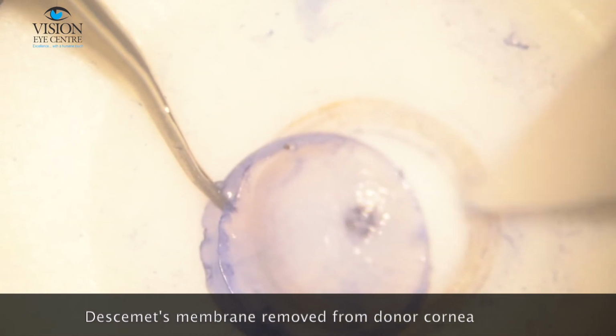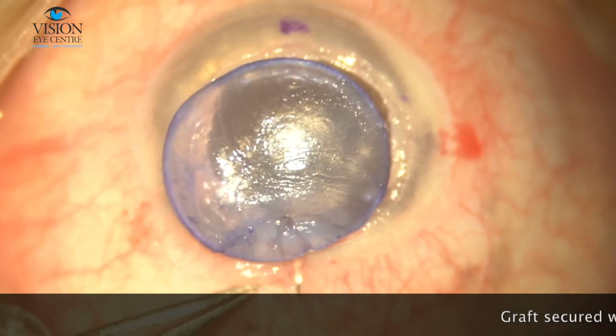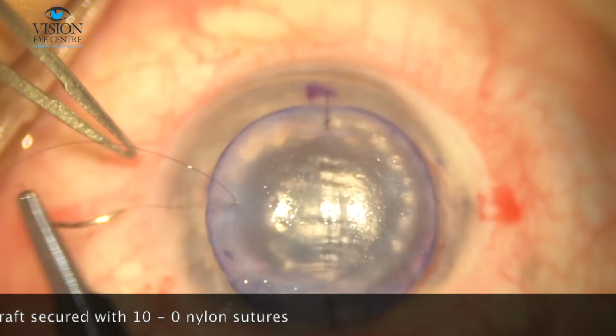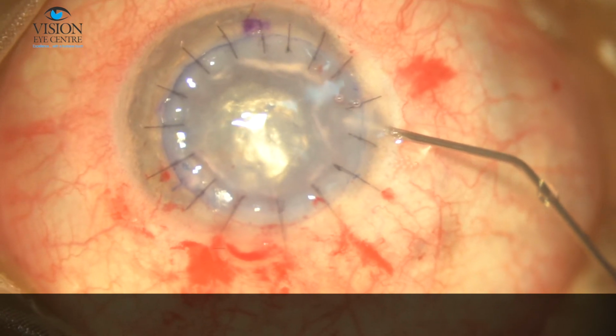So I always strip the Descemet's membrane from the donor cornea. The graft is then secured with 10-0 nylon sutures. Following this, air bubble, if any, in the anterior chamber is evacuated and the anterior chamber is formed.